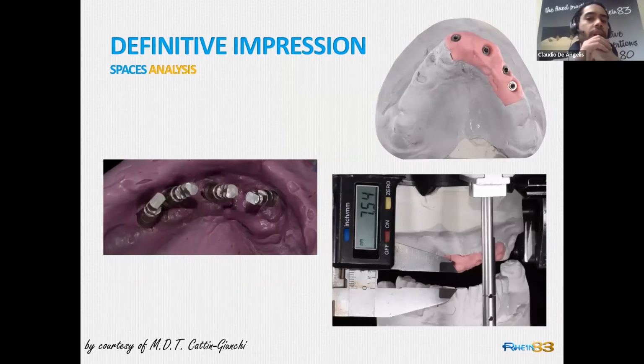After that, the doctor placed the implants into the bone after the recovering of the gingiva, after the osseointegration. They took a new impression, so to produce a bar.